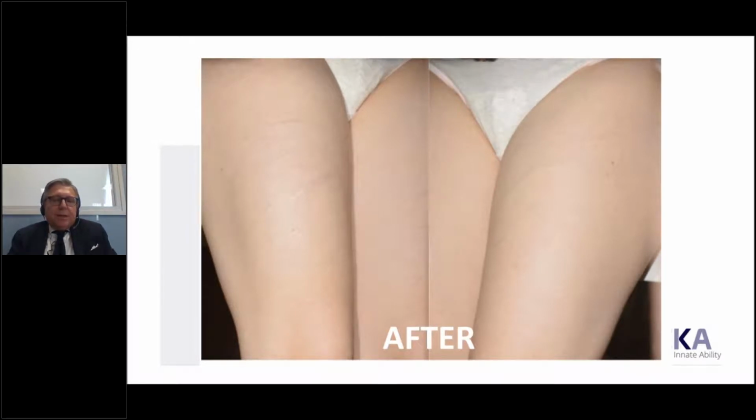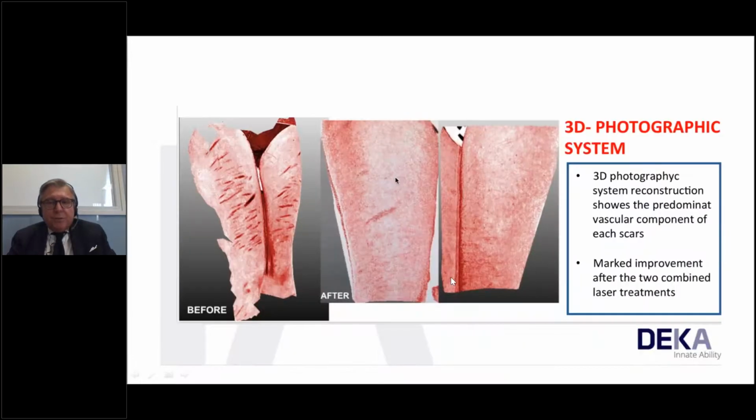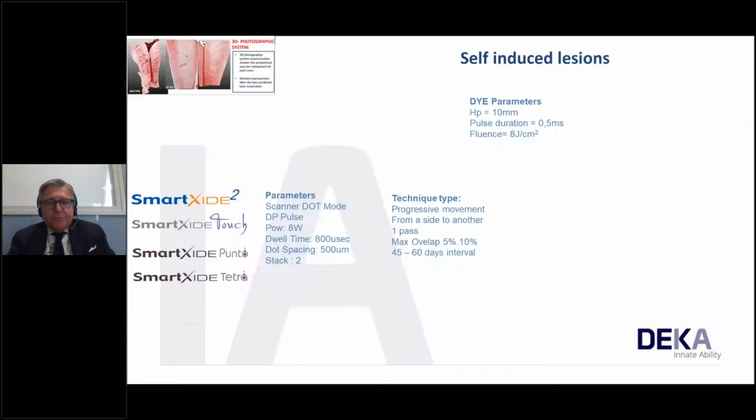You see, we are really proud because the psychiatrists that follow the patient called us to thank us because we contributed to the psychological balance of the patient. You see here the 3D images and the evaluation of the chromophore that is improved after the procedure with the pulse dye laser and fractional.